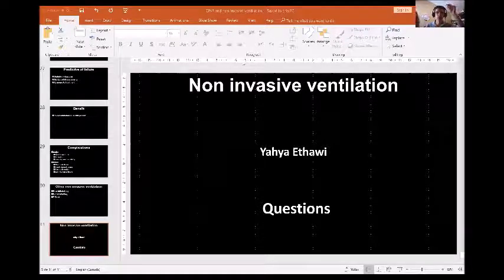But it's better for the machine to measure it, because you can use nasal flow, not CPAP, to give you CPAP. And if you give 10, then it's giving you 7 pressure, almost. But that's not measured. It's not regulated, so you cannot use it. So the machine should calculate how much pressure you get. Does patient age influence? No, the patient age does not influence. It's the case of the patient, what exactly you want to do. If you are not transporting and you have the machine, use variable flow.